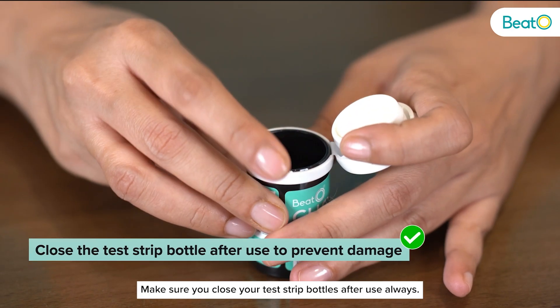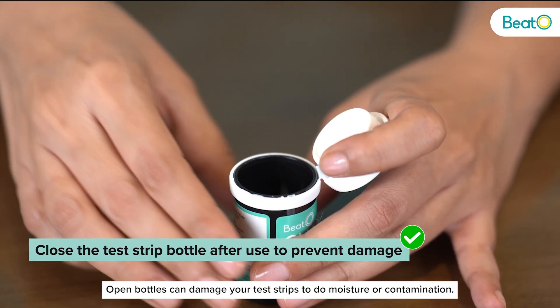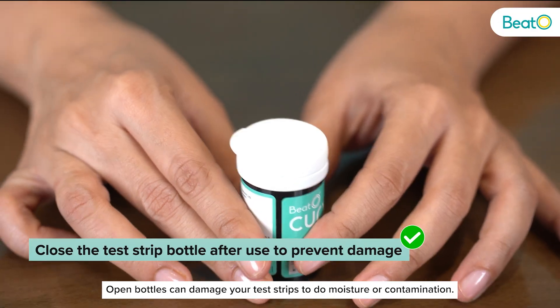Make sure you close your test strip bottles after use always. Open bottles can damage your test strips due to moisture or contamination.